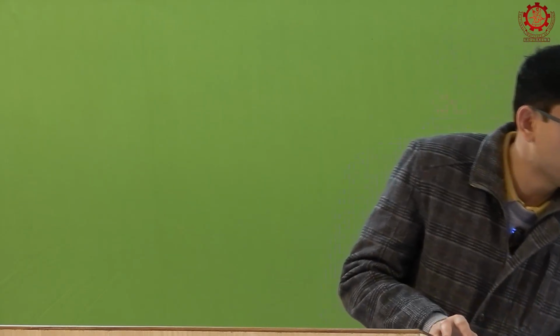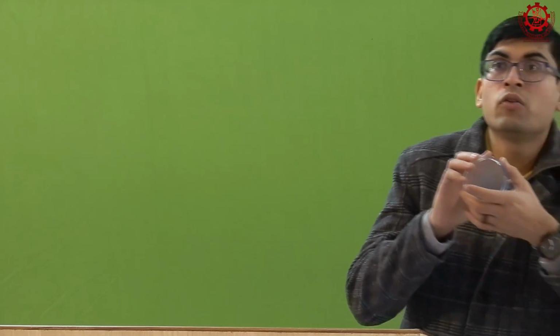the tissue would be probably, I don't know, half of this, right? So let's say that this is the tissue. You can't have that entire image taken in one shot. So what happens when the tissue is digitized is you break it up into tiles, and then small sections are digitized and stitched together. And that's how they create the bigger image. But they don't do it multiple times.